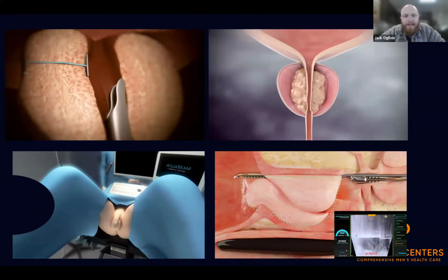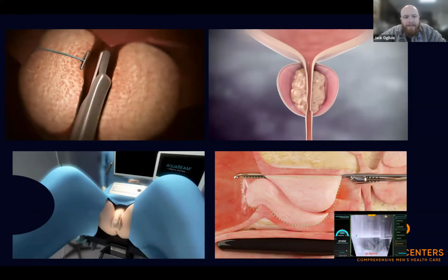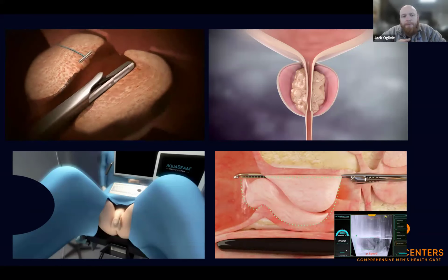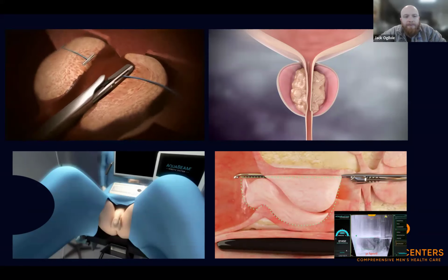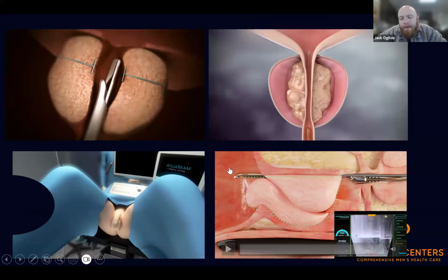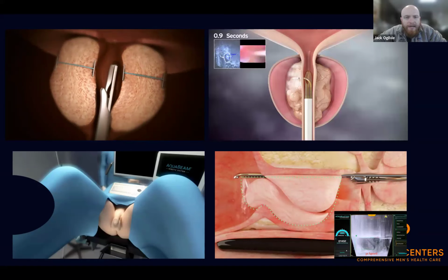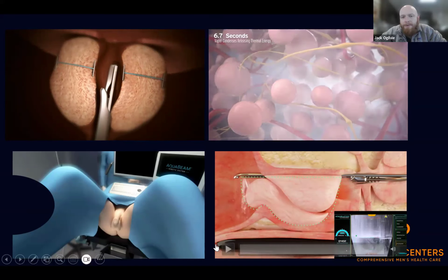There are a lot of newer technologies, though, that they use. In the upper left here, we have something called Urolift that you may have seen. Just to show a brief video on that, that's an image of the prostate, and there's a device in the urethra, which is the channel going through the prostate. They're essentially pushing the prostate out of the way and using these tethers to hold that tissue out of the way to improve the flow through the prostate. Up on the upper right here, we have something called Rezūm, which is another procedure where they again go in through the urethra, and here they're using a device to inject steam into the tissue of the prostate to help kill off some of the tissue and cause tissue resorption to open up that channel through the prostate.